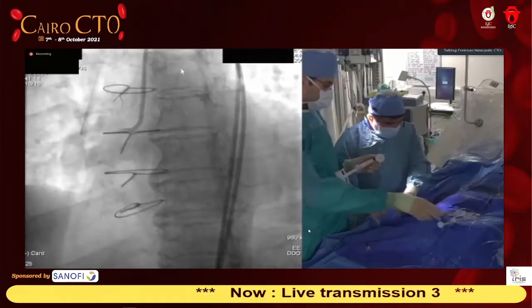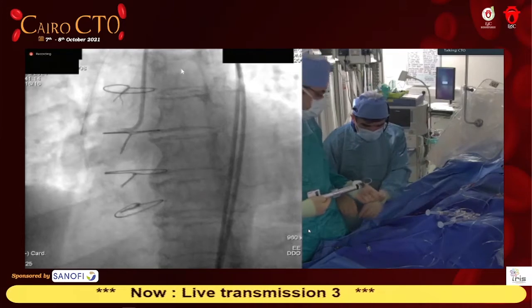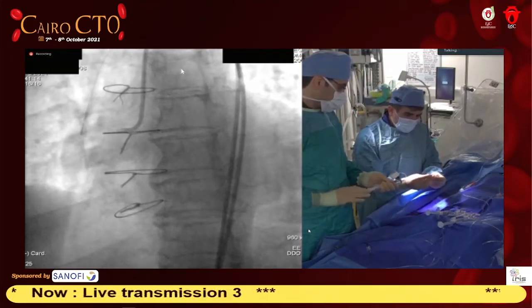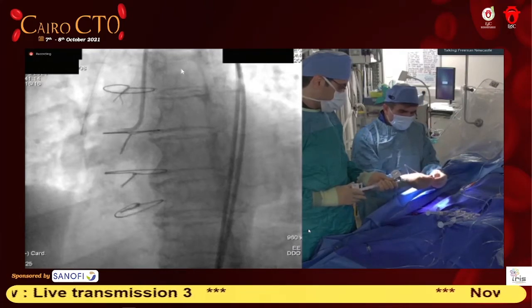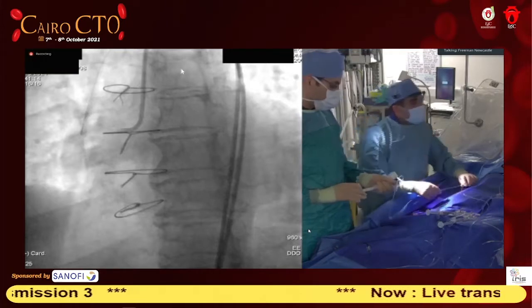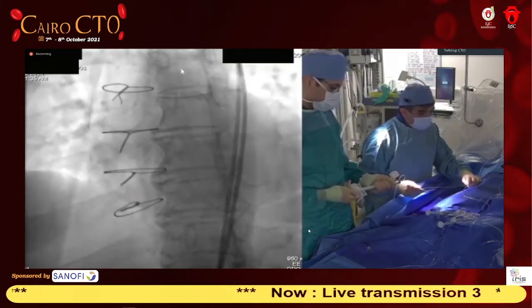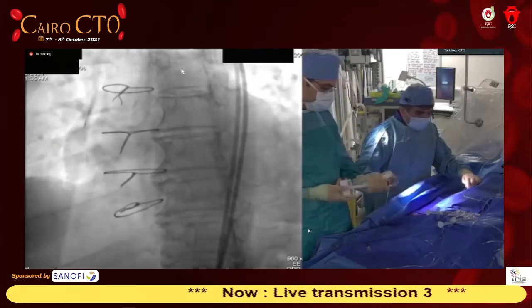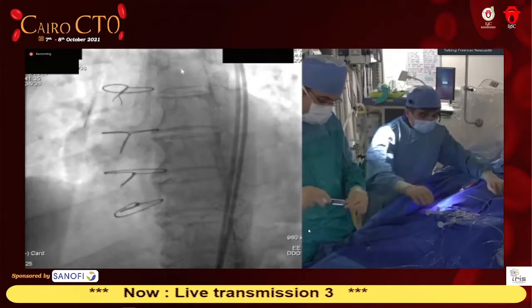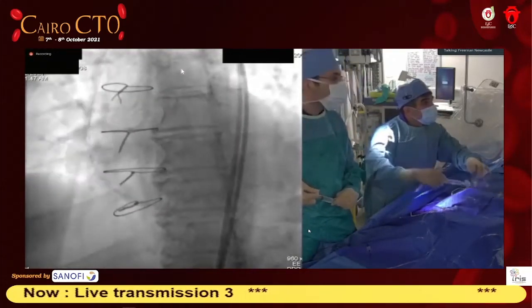The remaining issue would be the size of this, the site of stenting. I mean, where to stent. Yes, this will be the problem. This is a dynamic thing. So what we'll do once we've opened the artery, let us go, please. Ideally, we should try, but I'm going to go to 16, keep it at 16. We have also a distal lesion at the ostium of the PDA. Absolutely. To be honest, I don't know where the PDA is coming from. So we'll see now if we open it antegradely. Okay, here we go.